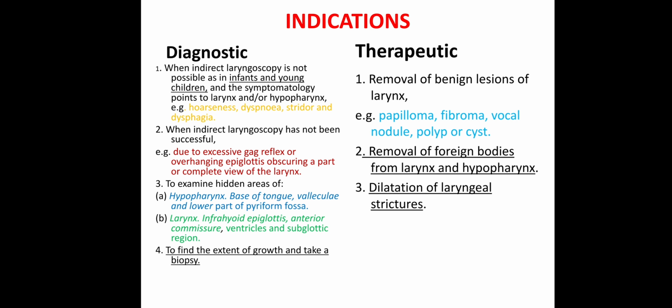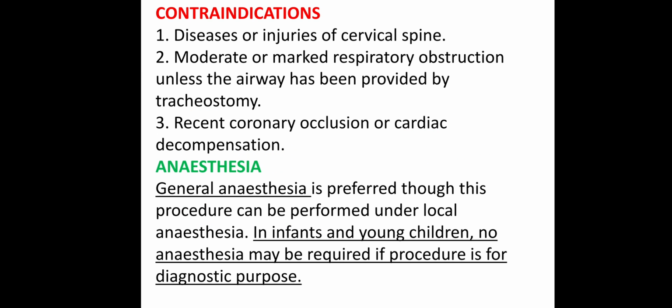Therapeutic indications include removal of benign lesions of the larynx such as papilloma, fibroma, vocal nodule, polyp or cyst, removal of foreign bodies from the larynx and hypopharynx, and dilatation of laryngeal strictures.